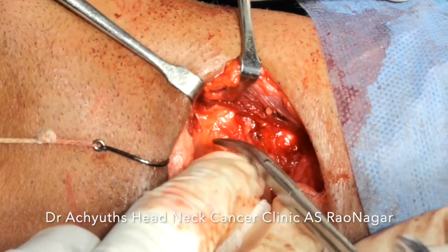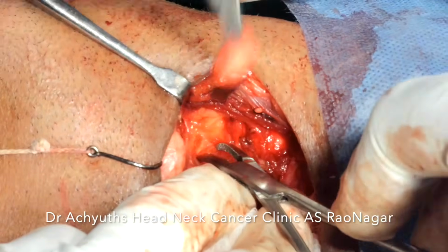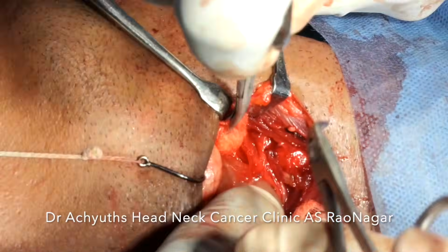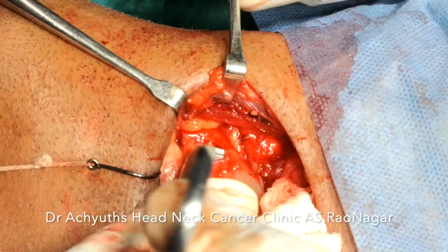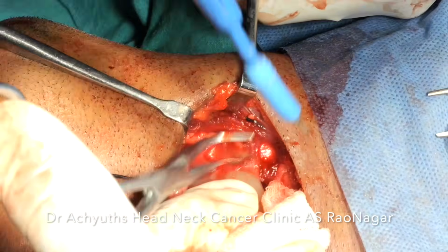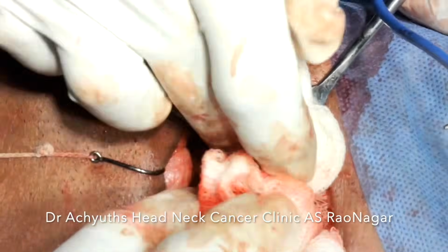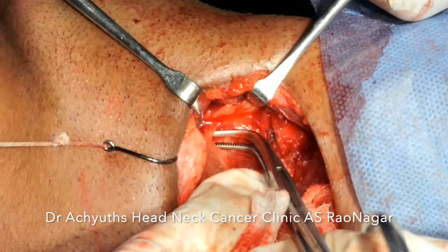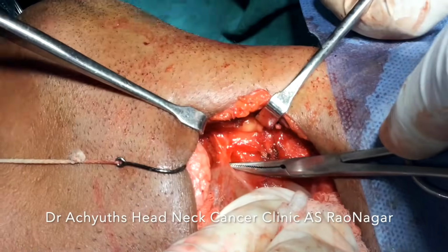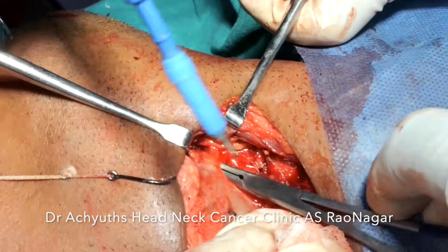So in this way, gradually the cyst is being pulled from the internal component into the neck. The external component is already out. It is completely divided. Now the internal component is being divided. So a little more patience. Now this structure we are dividing from the pre-epiglottic space and the paraglottic space.